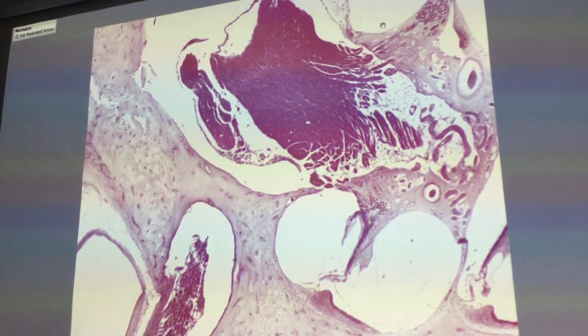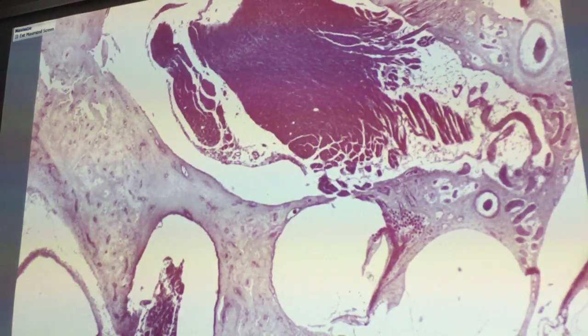Compartments. This is not a structure, it is a pinch of the bone. This extension belongs to this area. It's not a membrane or something like that. It's a broken part of the wall. The basilar membrane, isn't it? The organ of Corti is located on the basilar membrane.